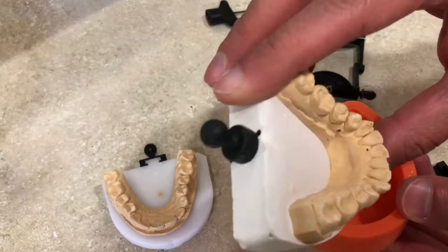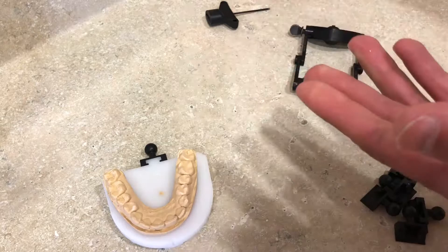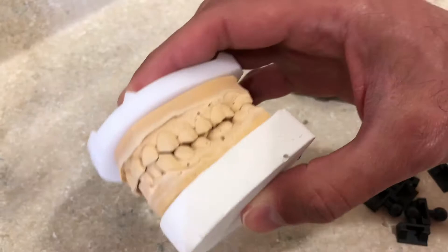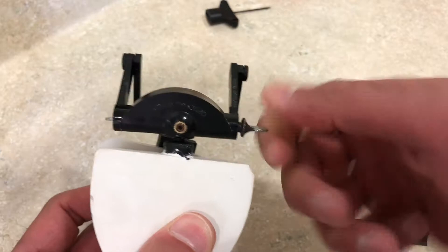You put up your model, it sets, and you pull it out — it becomes like that. After it hardens, you just pull it up, and now you have the opposing model which you can use with the Amman Gearbach or Zizer plate. The way you do that is very simple: you come this way and mount them by hand.